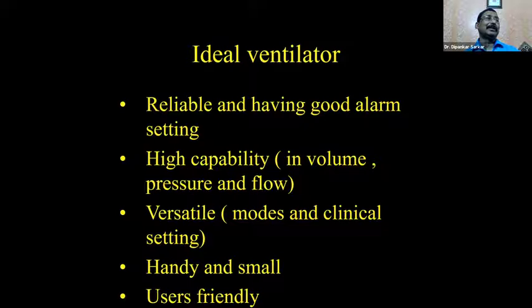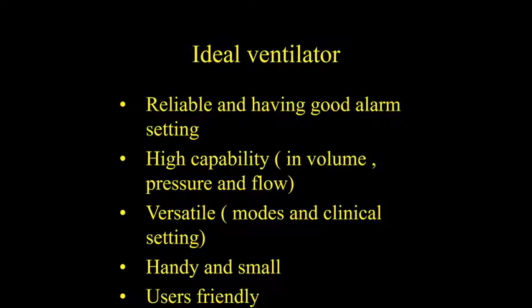Now in a COVID patient, that patient will require a ventilator. Okay, take the ventilator and run. So that's the thing. So handy and small. And it should be user friendly. There should not be too much jargon.